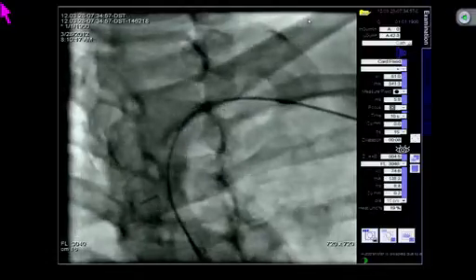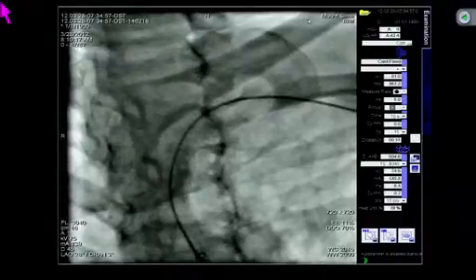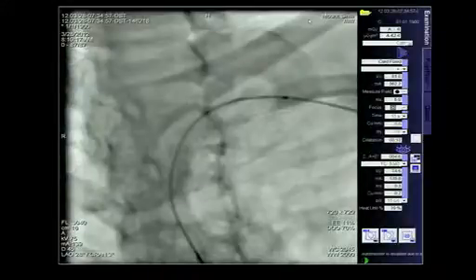a vertebral antegrade flow or a retrograde, reversed flow. Essentially, is this a stenosis of a grade maybe 80%, 75, 90, or is this a subtotal stenosis already associated with a subclavian steal syndrome via a reversal of the vertebral flow through the circle of Willis? That is very important because in this case we have a very high gradient, 100 millimeters of resting gradient, and certainly even higher when the patient exerts her left arm.